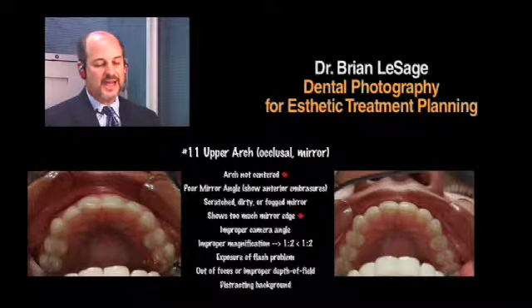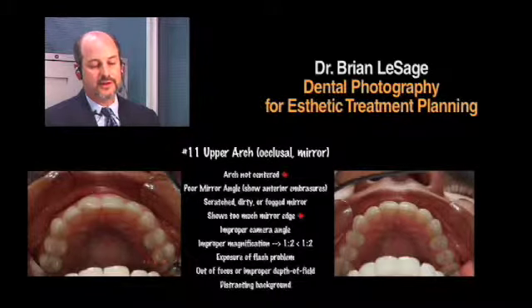You can see the lip is slightly on the teeth here. We don't really want to see up the patient's nose. We don't really want to see their eyelids. She's a very pretty gal, but that's beside the point. We'd like to get this lip off of the teeth. This is a little bit more in than I'd like, even though you can still see the facial form. I'd like to actually see the facial embrasure.